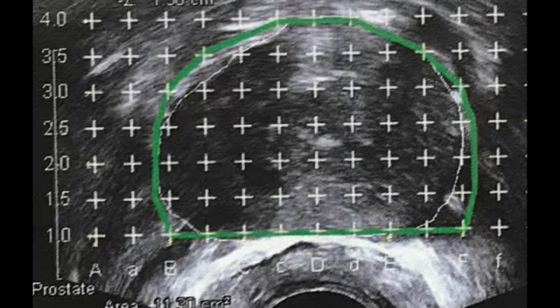It's also been used for many years to guide implant procedures. A classic example being prostate brachytherapy, where you have a probe that you can visualize the prostate, and then you insert seeds as you're visualizing it with the ultrasound. So it's important to understand this modality at some level, and so hopefully this video will provide you with some basics. Here we go. Let me just start by showing an image.